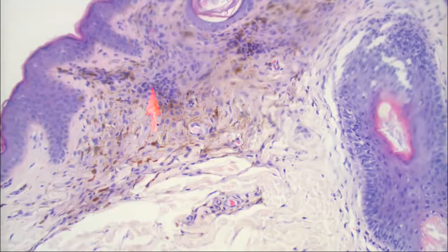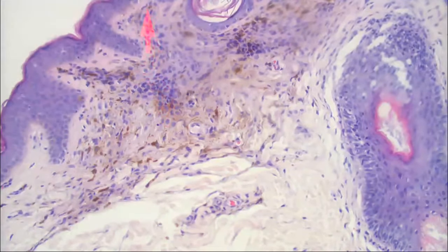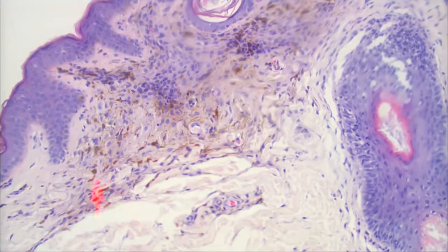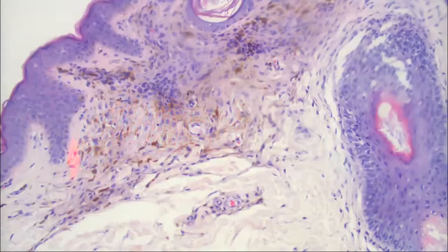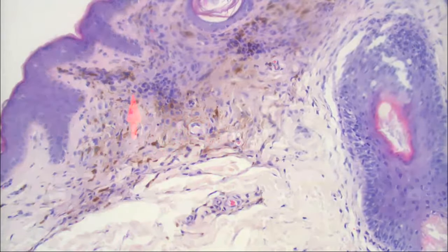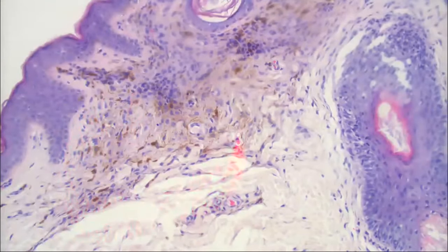So these are not dendritic here, though, are they? These are more small round. So what do we have? What type of nevus gives you these dendritic melanocytes like this in the dermis? Don't overthink it. Dendritic nevus? Dendritic melanocytic nevus? Yeah, but what do we call that usually, clinically and histologically?